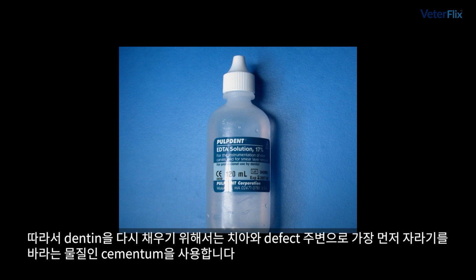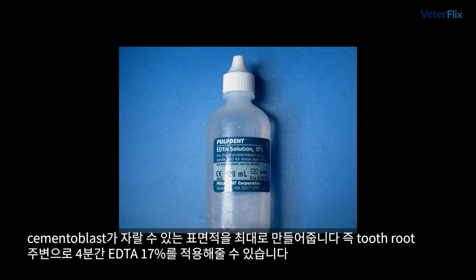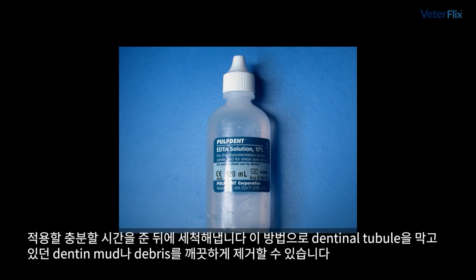So when we're looking at trying to repopulate that dentin with new cementum, which is the first material we'd like to grow on adjacent to that tooth and that defect, we'd like to have as much surface area for those cementoblasts to populate as possible. So we can use this EDTA 17% solution for 4 minutes adjacent to the tooth root and allow that to sit and then rinse it off.